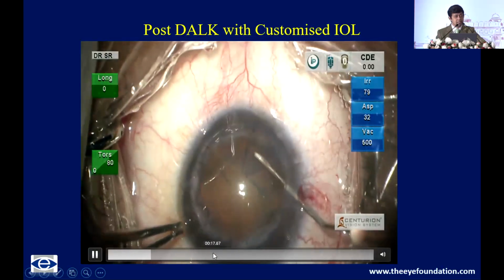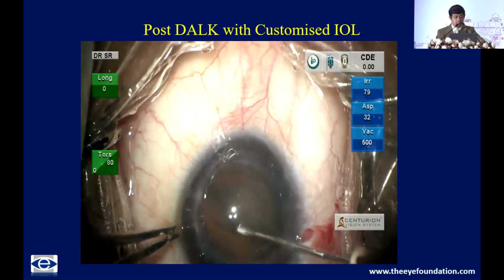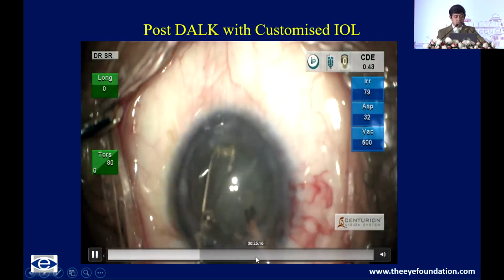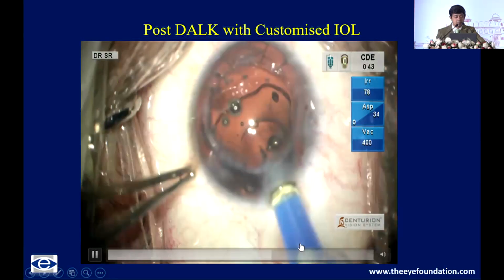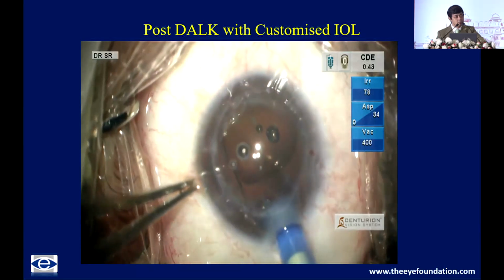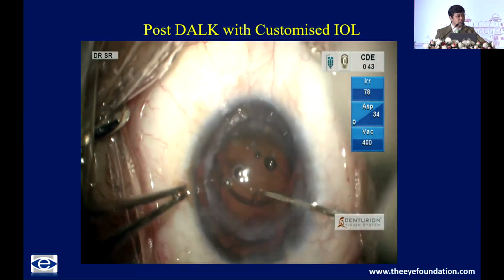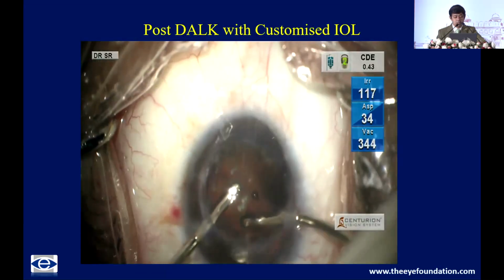Here again the aim is to debulk the amount of ametropia that the patient has. Using a customized toric lens, no financial interest, but these Ultima smart toric lenses which come in very high astigmatic corrections can also be done. The aim is really not emmetropia. We are debulking the power. There will still be some residual power which the patient may wear with, in their glasses, but both their uncorrected and best corrected visual acuity improves significantly.